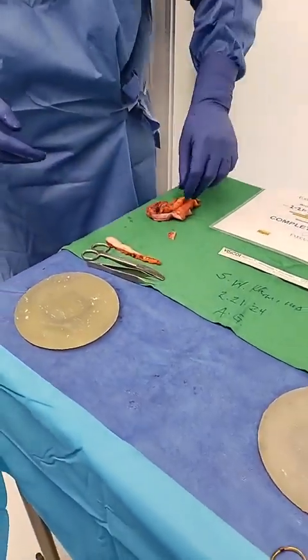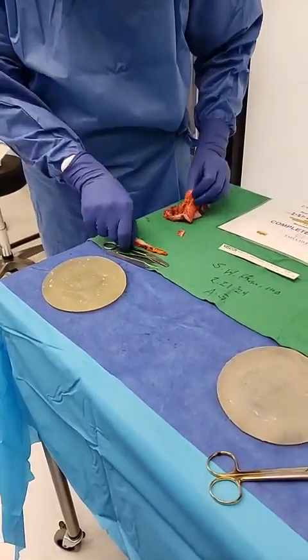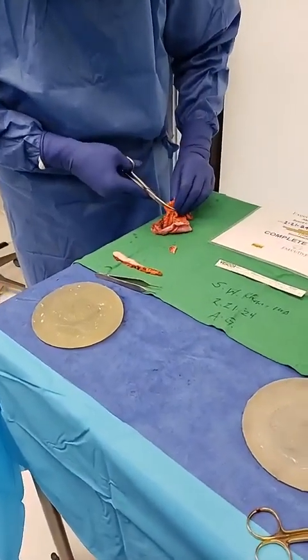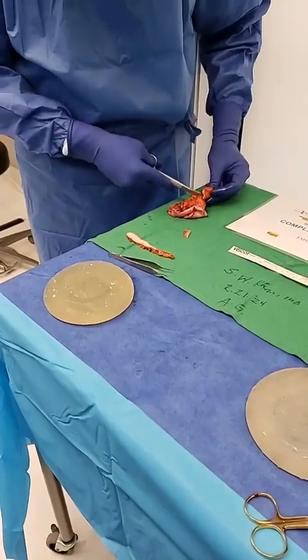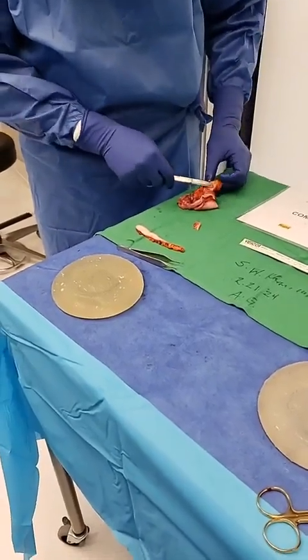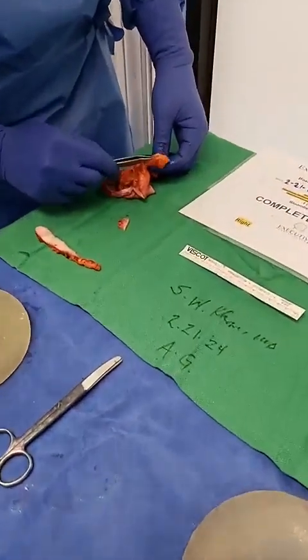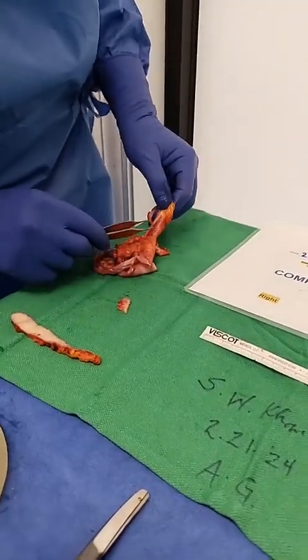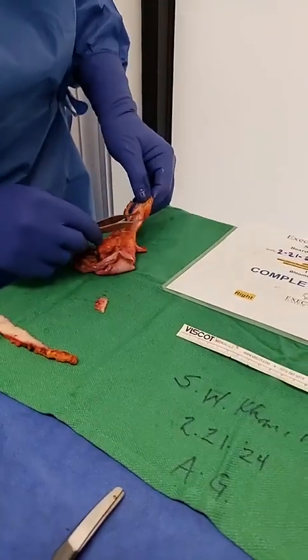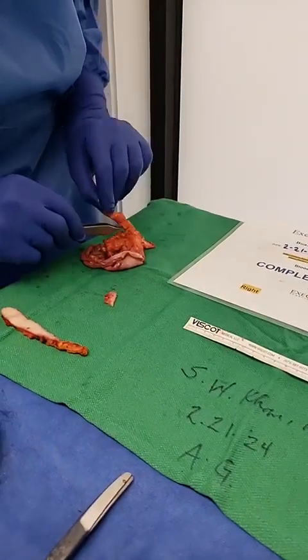This could have been a focal rupture. If I touch it, you can see it is relatively very hard, very thick. So all of the inflamed tissue has been removed, and no inflammatory burden is left behind. You can see, look at this small, it's very interesting. Let's have a look here. So look at this, this is a small pocket that was here as I cut open, that basically was feeding into this, so as it was closed like this.